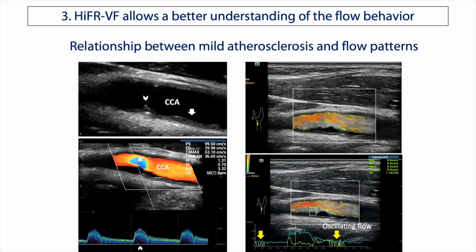Let's consider now the role of vector flow in the presence of a low-degree stenosis, in which the increase of velocity is not relevant and the role of a conventional ultrasound Doppler technique is less evident. Generally speaking, VFlow allows a better understanding of the streamlines' progression and vorticity formation and depicts the hemodynamic influence of some plaques which would otherwise be considered not significant.